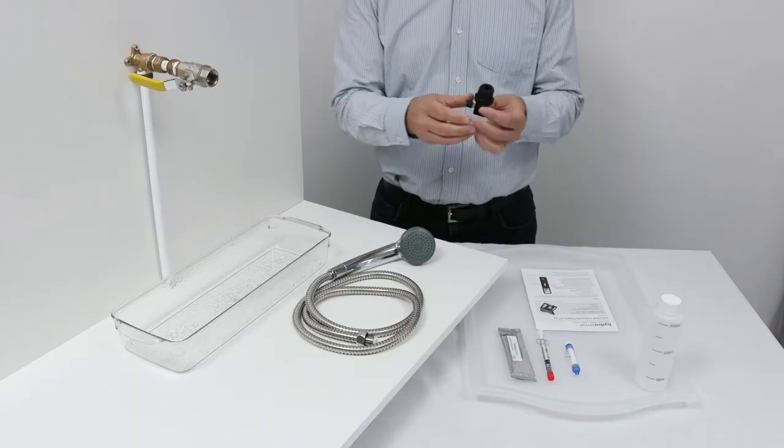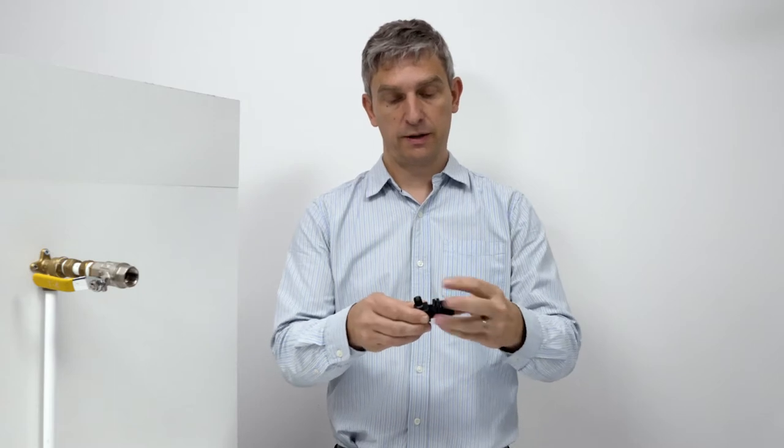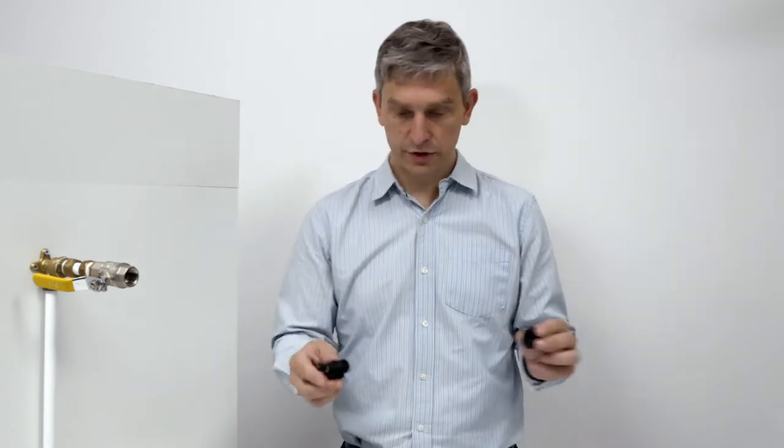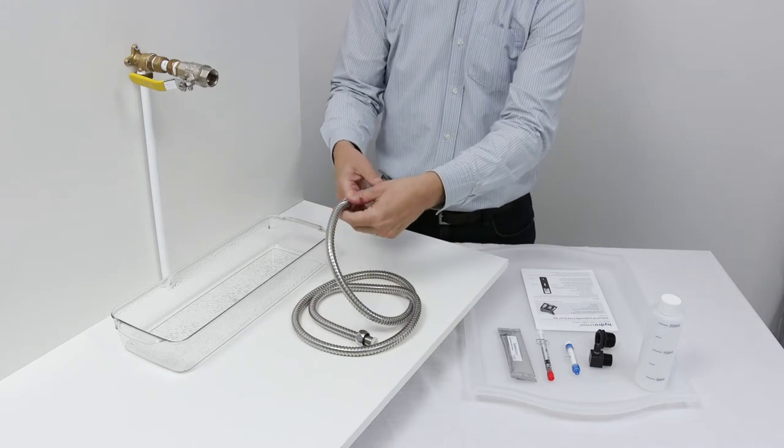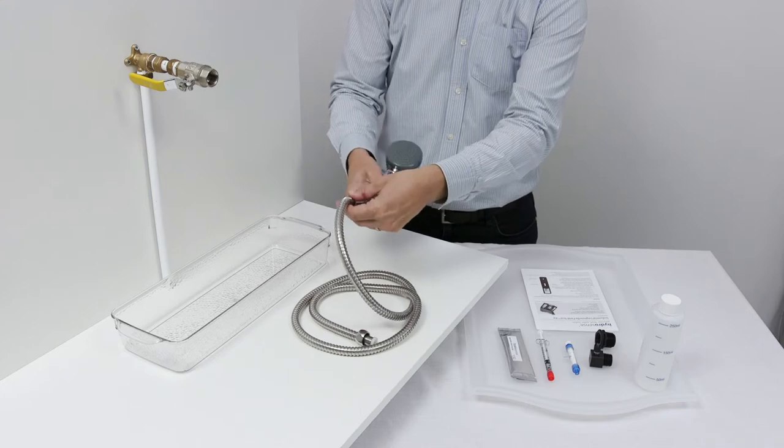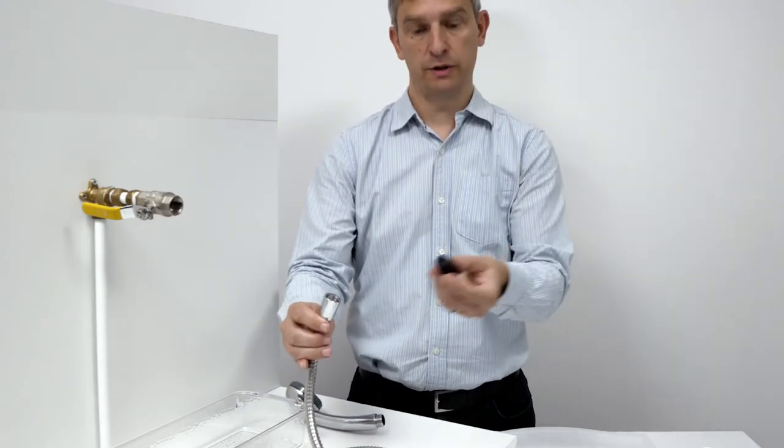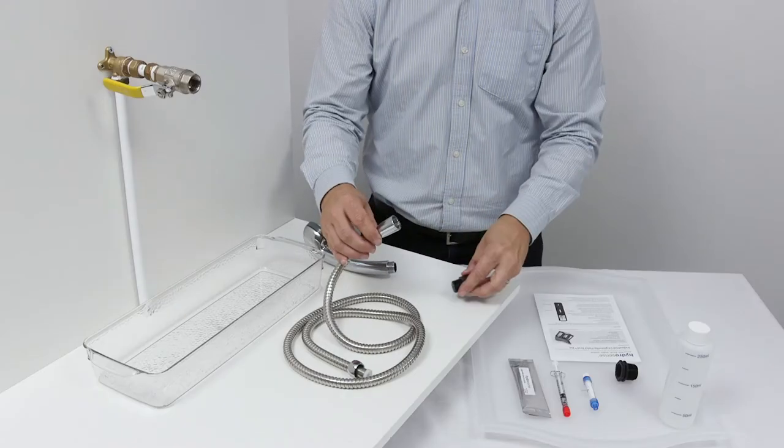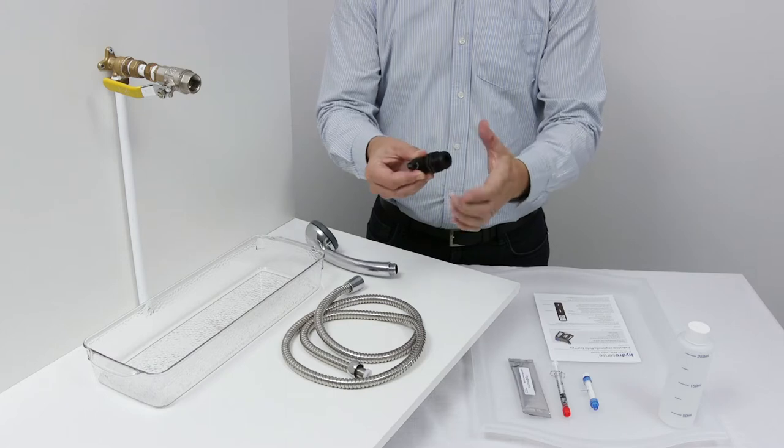The test kit comes with an adapter which has three-quarter inch and half-inch threaded adapters. If you want to sample from a shower head like we have here, detach the shower head—that should just unscrew. In this case, that's a half-inch fitting, so we can use the half-inch adapter. If however you needed the three-quarter inch, that just screws on like so.